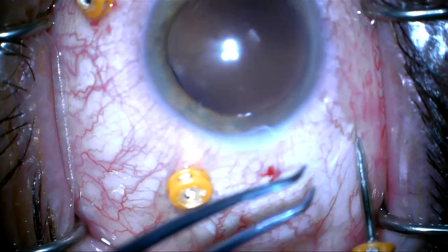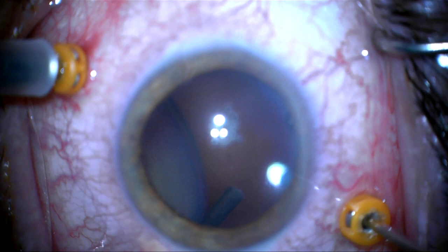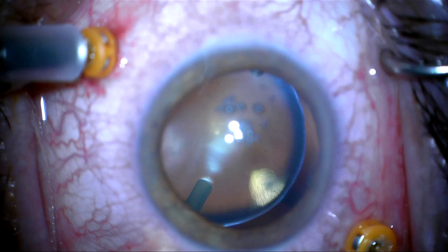This is a patient with Weill-Marchesani syndrome. He has ectopia lentis and a completely dislocated lens into the vitreous. I placed my pars plana trocars and there is vitreous in the anterior chamber, so I'm cleaning this up. You can see the crystalline lens floating, hanging by about three zonules.